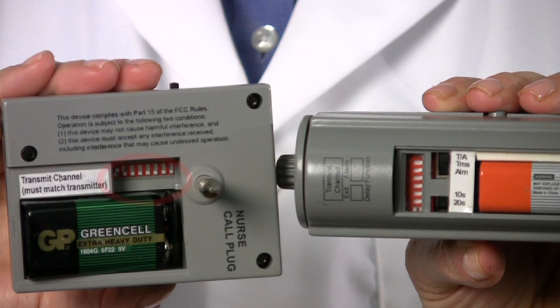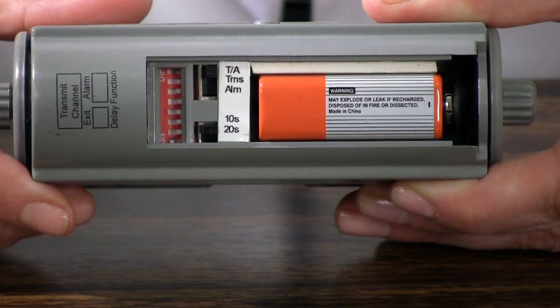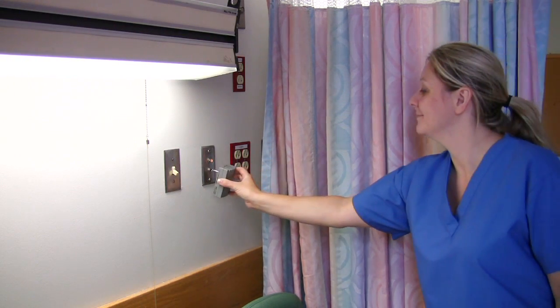Now that your sensor unit is set up, tested, and ready to use, set up the nurse call receiver. After installing a 9-volt battery, set the eight-position DIP switches to match the channel setting of the PIR alarm unit. Be sure to set the transmit mode on the alarm to either transmit or transmit and alarm to enable communication. Now plug the nurse call receiver into the wall's nurse call jack and turn the power switch to the on position.